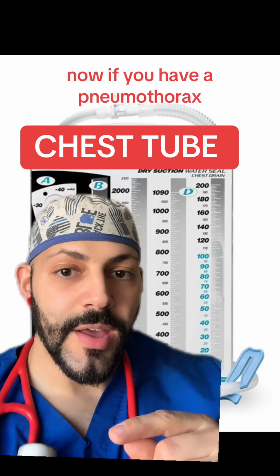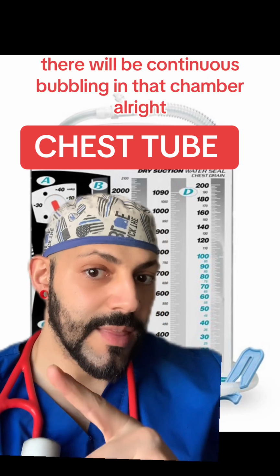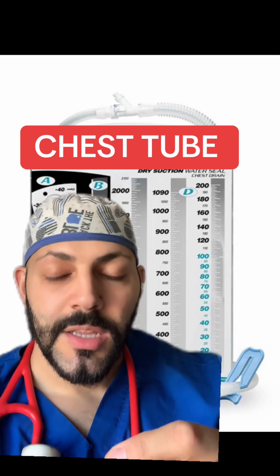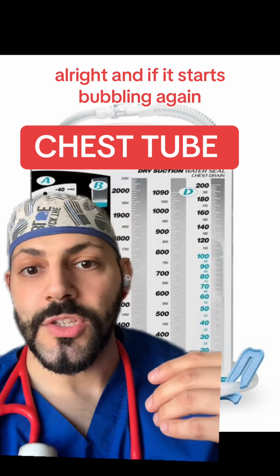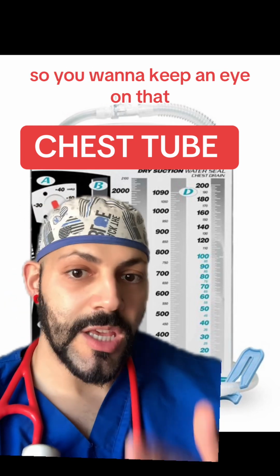Now, if you have a pneumothorax, there will be continuous bubbling in that chamber. All right. Now, when that continuous bubbling stops, that usually means that your lung has fully expanded, all right? And if it starts bubbling again, then for some reason it has collapsed once again. So you want to keep an eye on that.